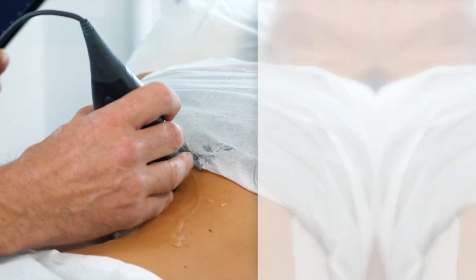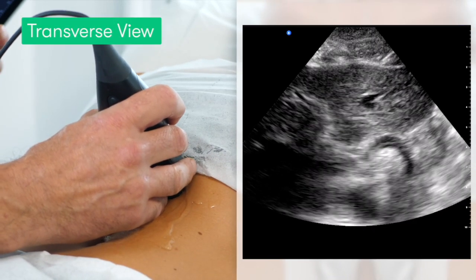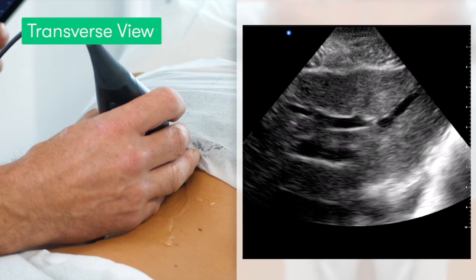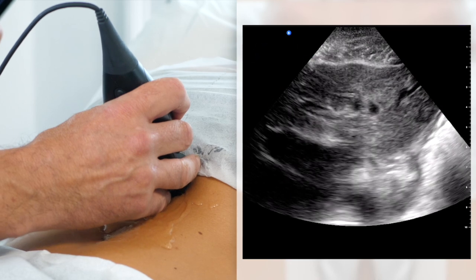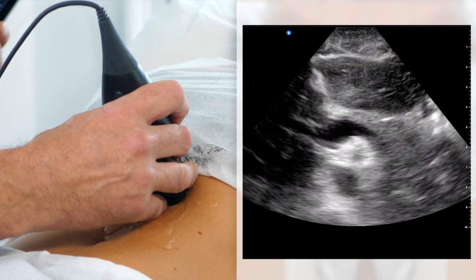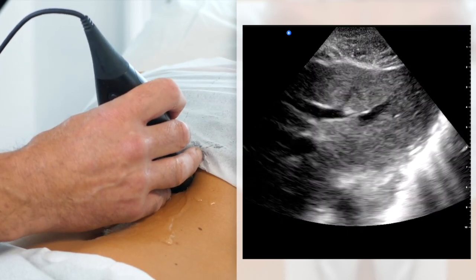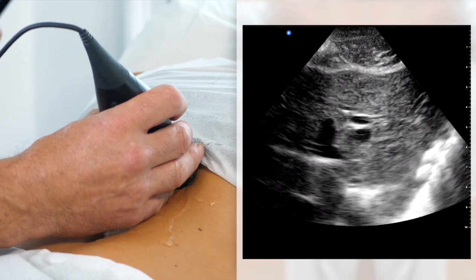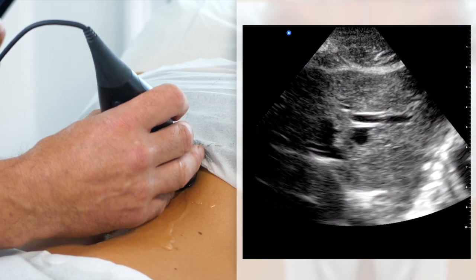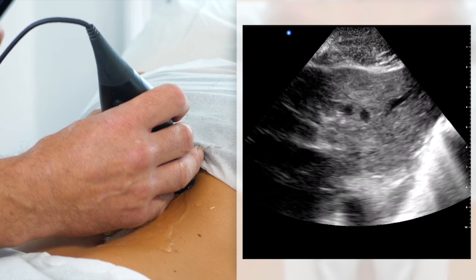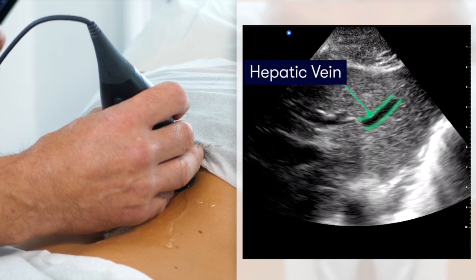To begin our scan, we start in the midline, looking at the left lobe of the liver in a transverse section. We can see the left lobe of the liver is the triangular structure in the middle of the field. Within the liver, we can see the vessels. There are two types of vessels: the portal veins, which have an echobright margin on the walls of the vessels, and the hepatic veins, which unlike the portal veins, don't have an echobright margin.